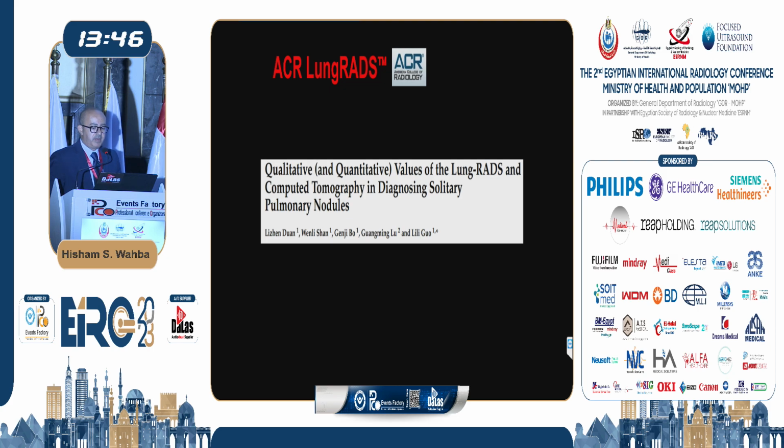Another study came later on, and they said we should compare the Lung-RADS with the description of the CT signs of the nodule itself. So what are the CT signs? Okay, not each and every single nodule, like Dr. Iman said, is a benign or a malignant nodule. Each nodule should be taken individually and should be adequately assessed.